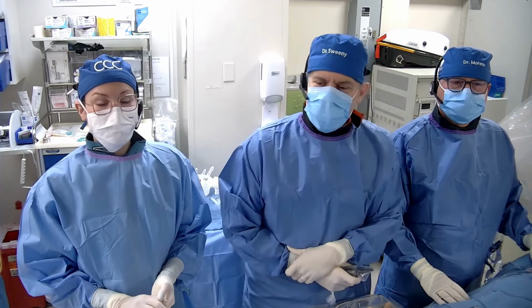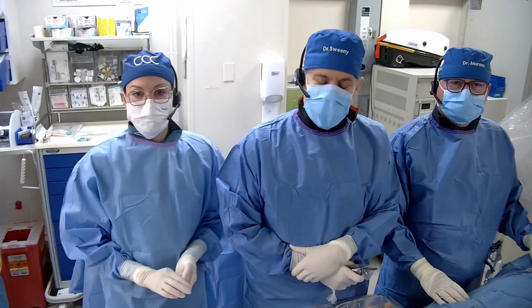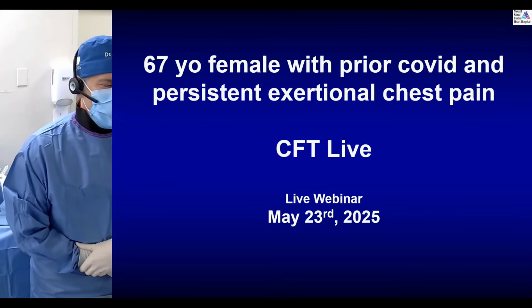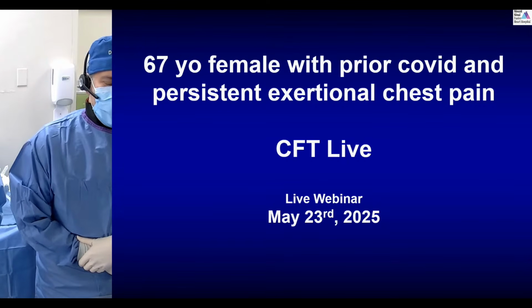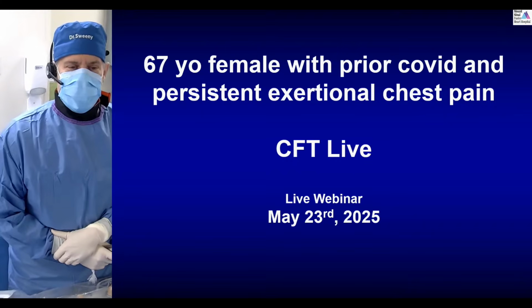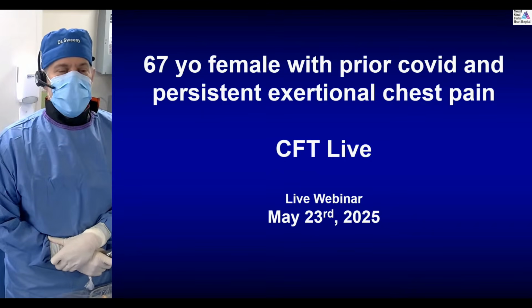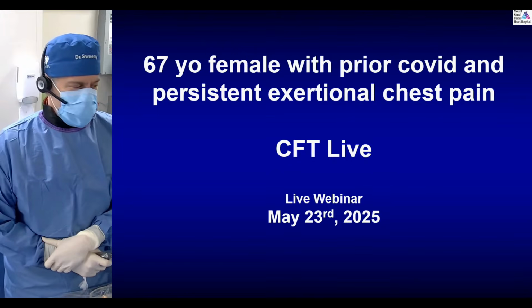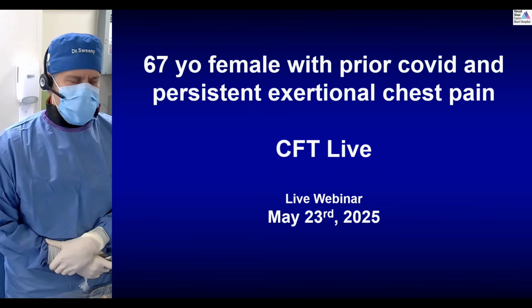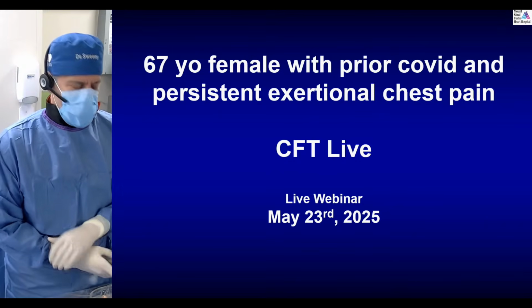And this is our second annual case, or second case of the year, of CFT Live, so Coronary Function Testing Live. The goal of this case is to really hammer down the procedural aspects of performing coronary function testing, why we do it, how we do it, and most importantly, how it changes our treatment for these patients. So today's case is a 67-year-old female with prior COVID and persistent exertional chest pain.